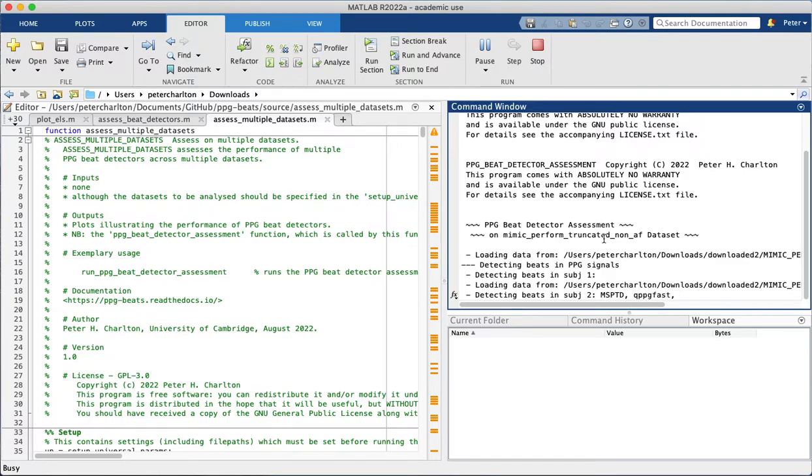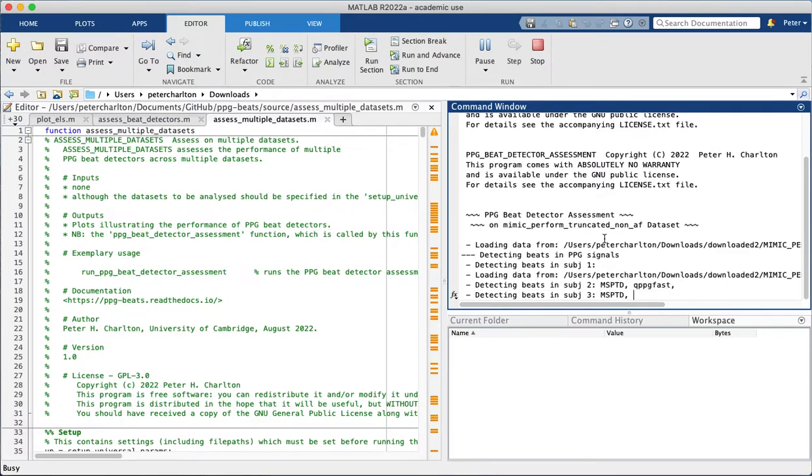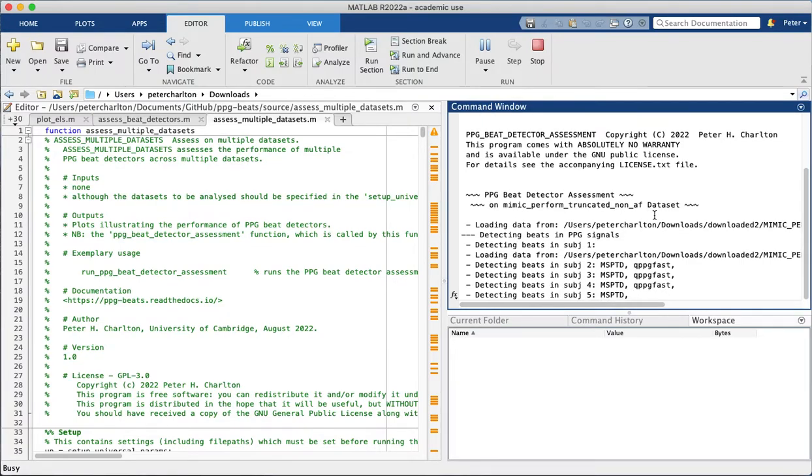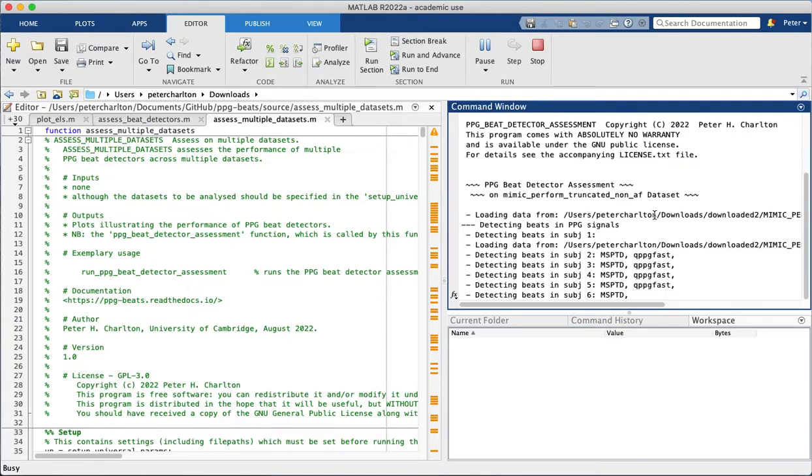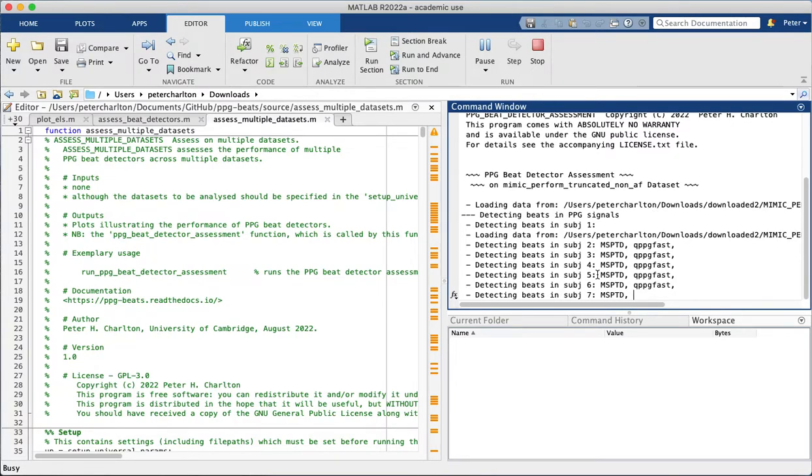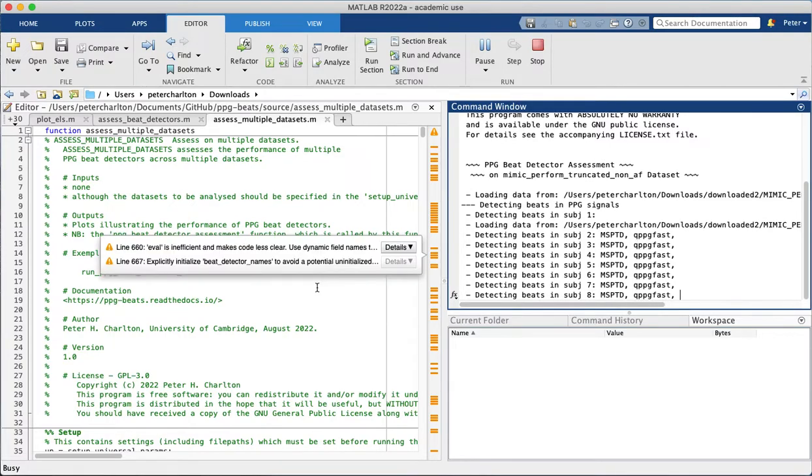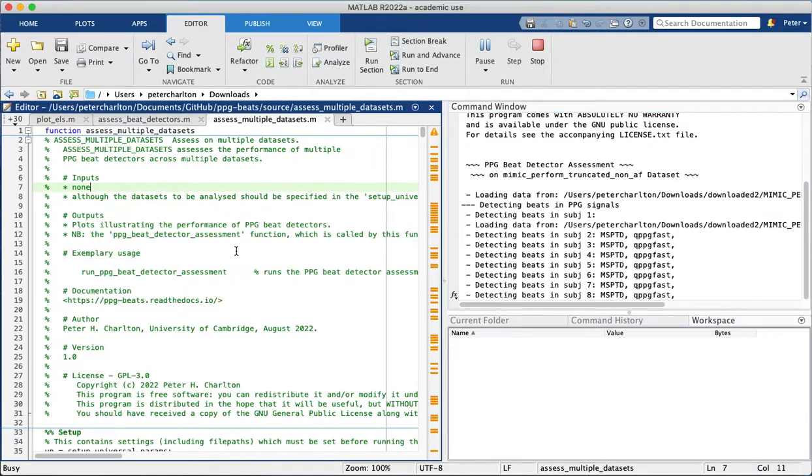So it's now going through this analysis on each dataset in turn. It started with this non-AF dataset, and I'll explain what these mean in a moment. It's currently detecting beats in the ppg signals in this dataset, and it's using two beat detectors, the msptd and qppg fast beat detector.